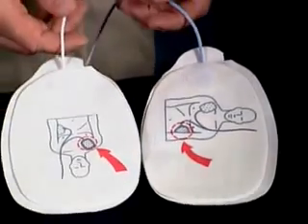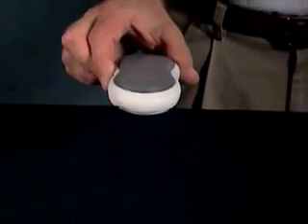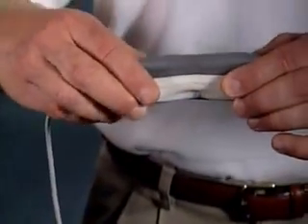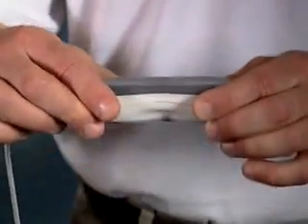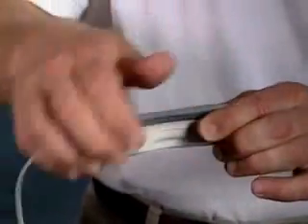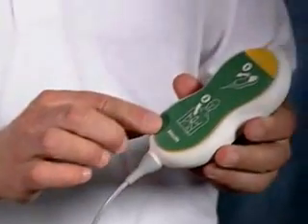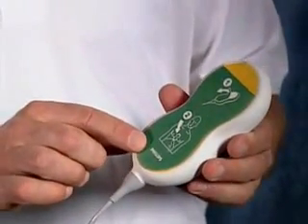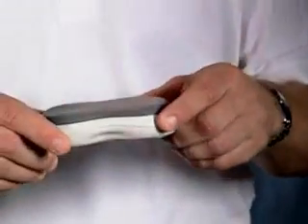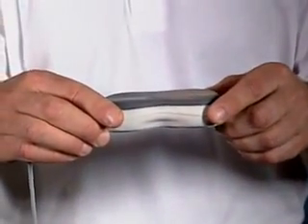To measure chest compressions, the MRX uses a small, reusable compression sensor. This sensor measures not only the motion but also the force associated with chest compressions. On the back of the sensor, there's a small adhesive pad, which can be used to affix the sensor in place on the patient's chest. Once in place, the sensor acts as a permanent landmark while you're doing CPR.